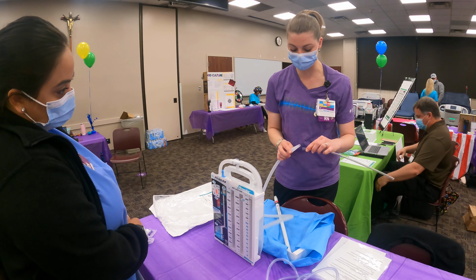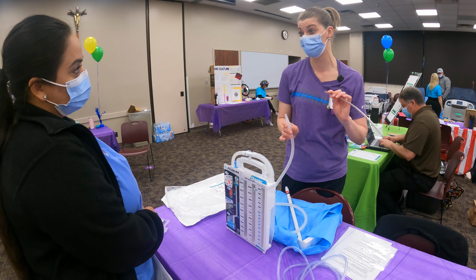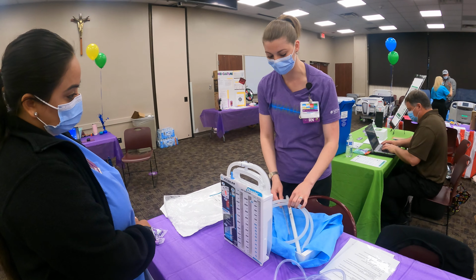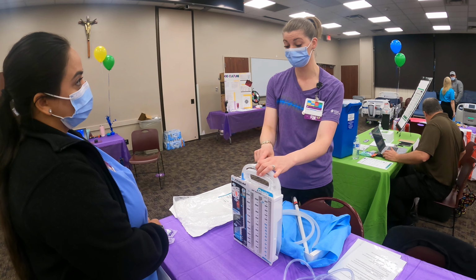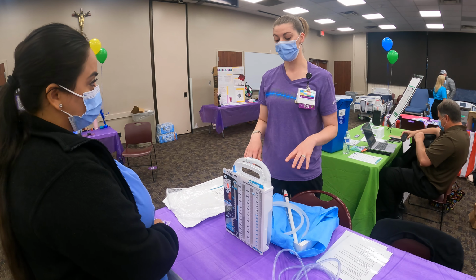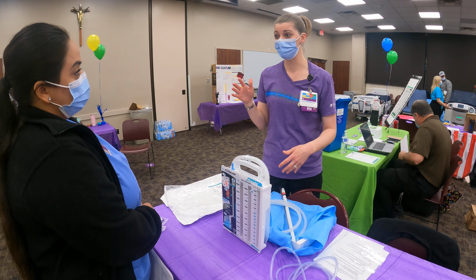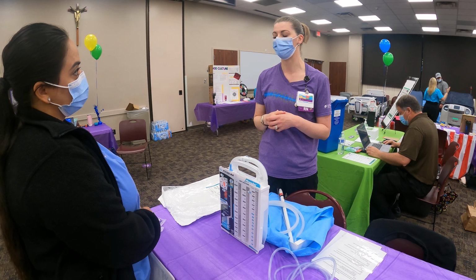The next place you'll look is here. This connection gets really tight sometimes, and it can get dislodged and cause leakage of air. So you want to check there. And then, other than that, this is your source. It can be your source for air leakage. You do all of that, it's still leaking, then you call us and say, hey, come look at it.